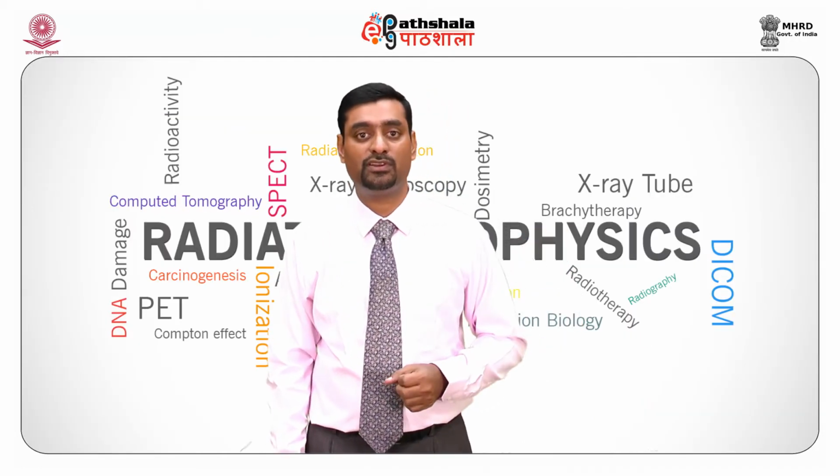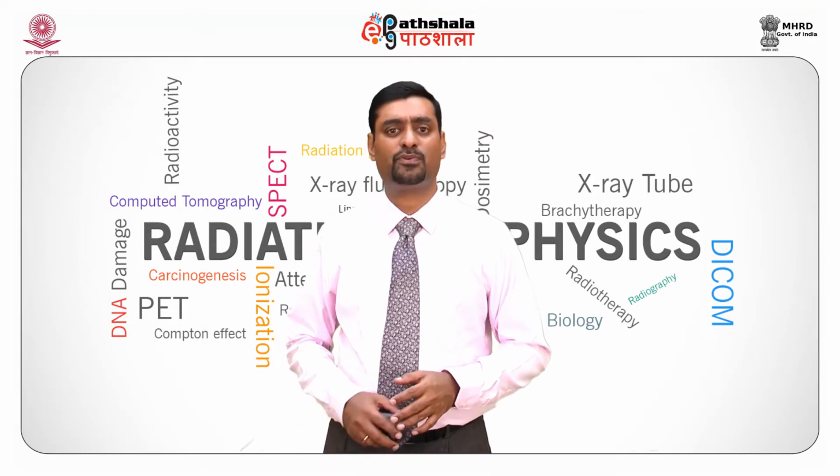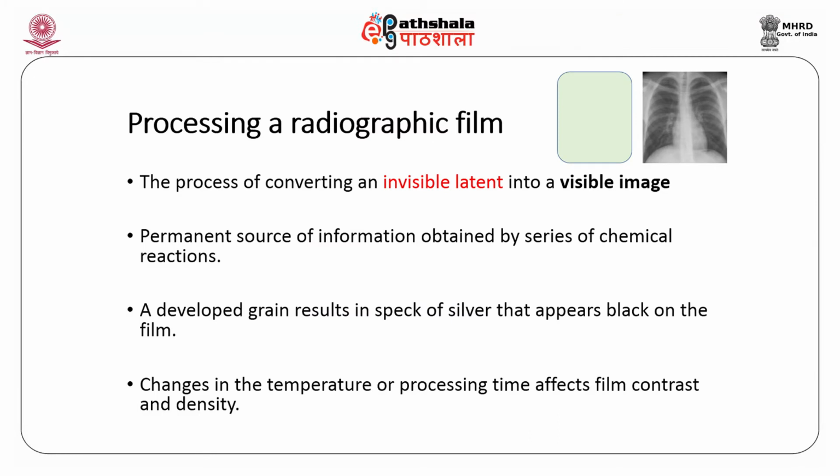Next, we move on to the processing of the radiographic film. What is processing? The process of converting the invisible latent image into a visible image is processing. It is a permanent source of information obtained by a series of chemical reactions.